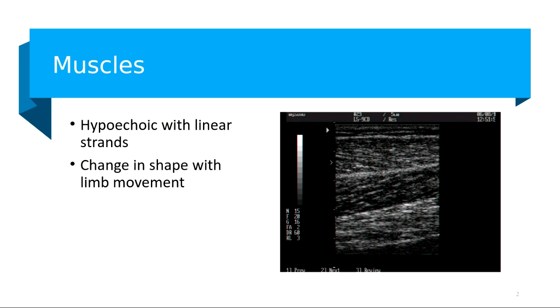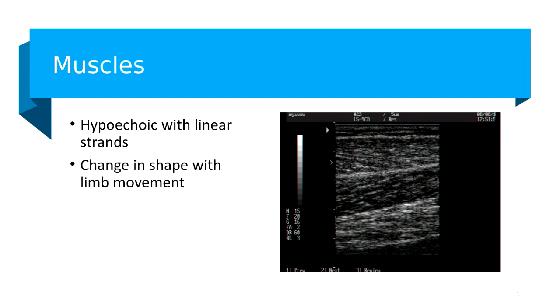General sonographers are pretty familiar with muscles. We looked at the muscles in the thyroid earlier. For the most part, muscles are going to have this hypoechoic appearance with linear strands or bands that are coursing through them. And if you have your patient move that limb, you're going to be able to see the change in shape of the muscle when they move.